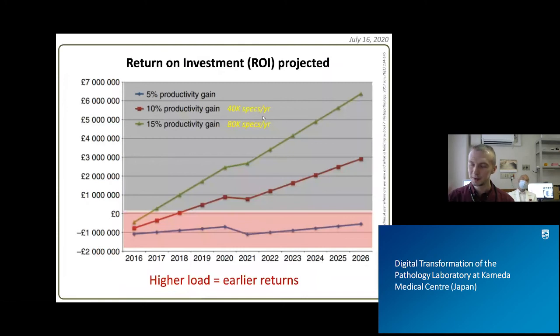Actually, there is a confusion when we do these calculations in the digital pathology field, because vendors calculate everything in slides, while we pathologists and our technicians calculate everything in cases. That's why there is a discrepancy, because a case can be 1-2 slides or 10-15 slides, or an autopsy case of 50 to 100 slides. So the metric used here is the number of specimens per year in your laboratory.